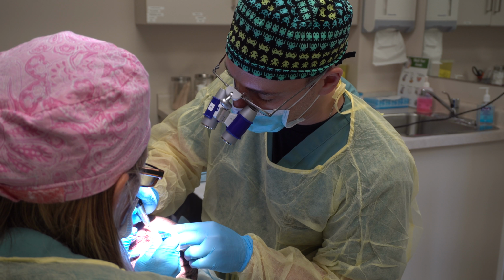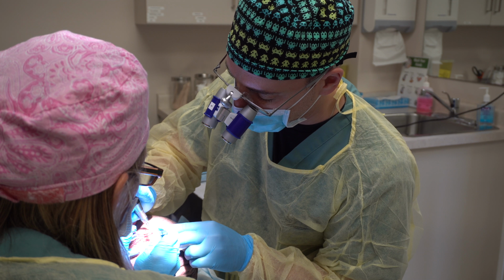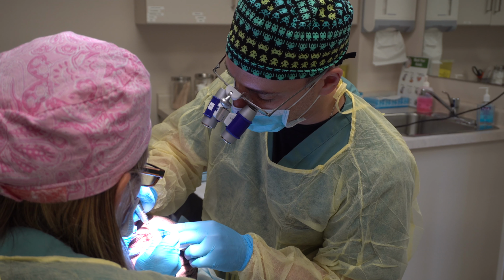What we do is we use a rotary punch to excise the grafts. We numb up the patient's head with local anesthetic, so patients can drive here, they can drive home, there's no sedation. And that motorized punch measures anywhere from 0.7 to 0.9 millimeters. It's very small. And with the magnification eyewear that we use, we're able to identify each individual graft and excise it using that motorized rotary punch.